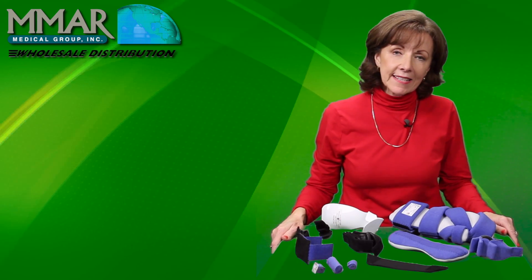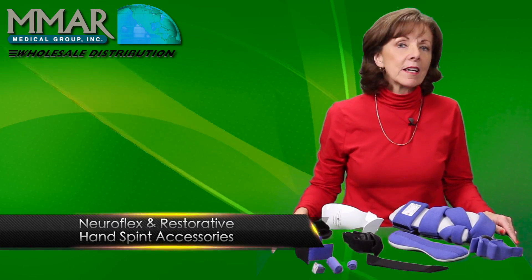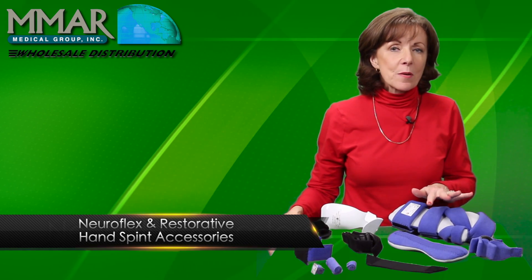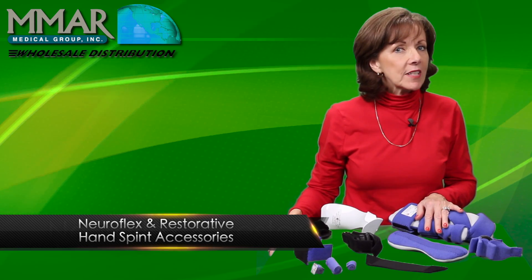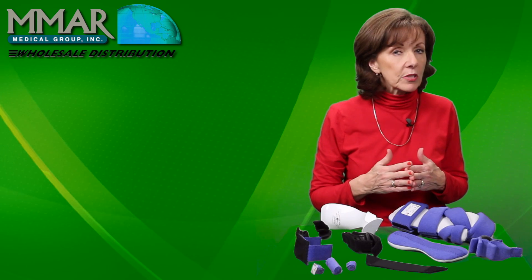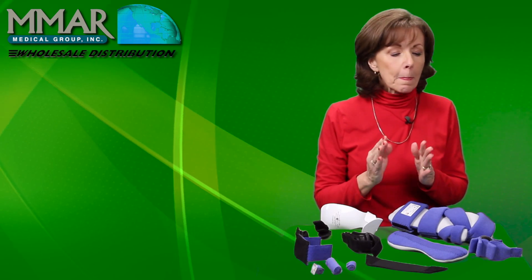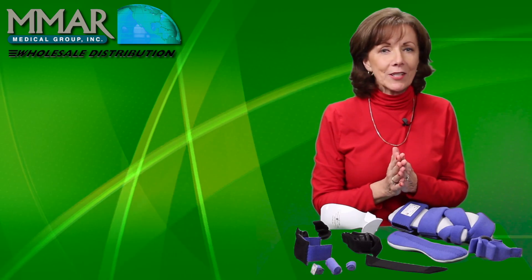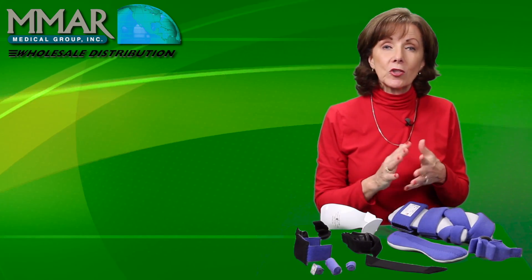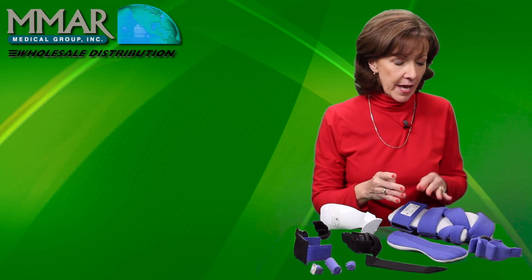With the variety of hand splints that we offer, you can pretty much choose one that will meet the needs of your patient. But sometimes we just have that really challenging patient that we need a little bit more. It's very simple, it's not high tech, you don't have to have a lot of education — it's just looking at the patient's hand and thinking about it.